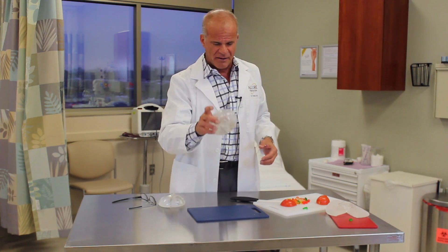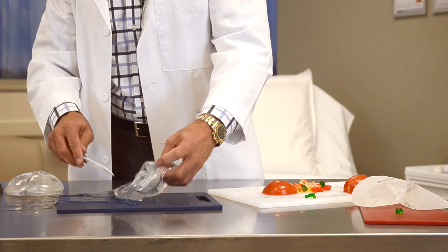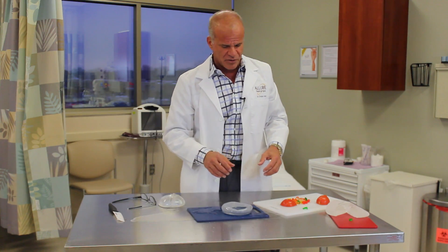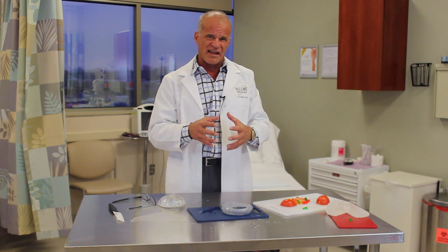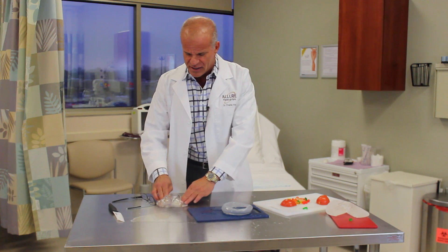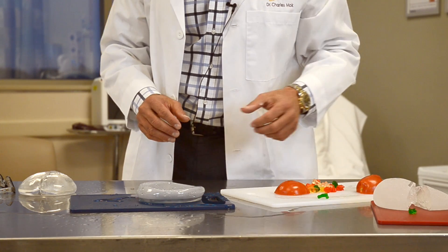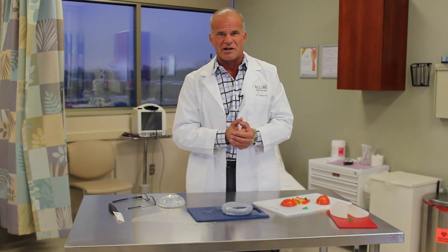The last one we have here is a saline implant — it's a mess, as you can see, completely different. So those are the three different materials: we have the classic gel, which holds together but is kind of gooey; we have the gummy bear implant, where you have two clean halves if you cut it; and then we have saline, which we're really not using that much anymore. So those are the new gummy bear implants.